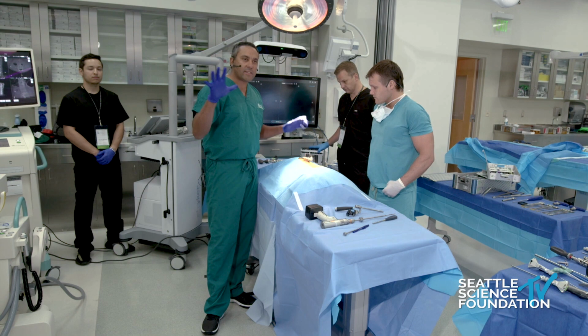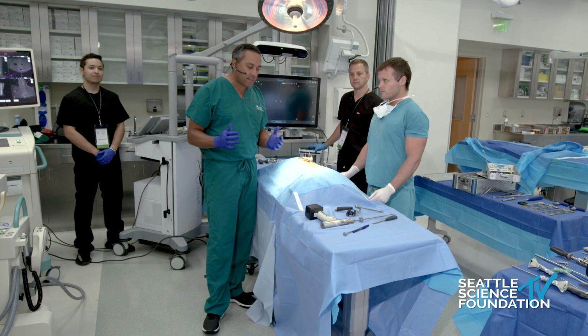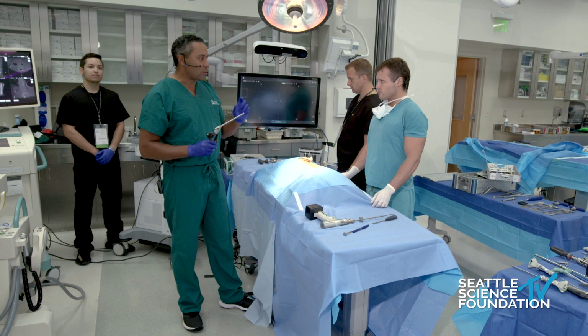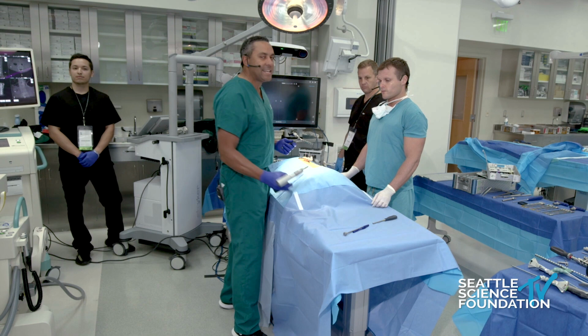So if you notice, none of us are wearing lead, and yet we are about to do percutaneous instrumentation. I absolutely loathe radiation, and so I have virtually no radiation exposure in my practice, even though, as I was told, I put in about 16,000 pedicle screws between 2016 and 2021, and virtually none of them were placed with fluoroscopy, x-ray, or any kind of radiation exposure. So I don't need 16,000 opportunities in a five-year period to get radiated.